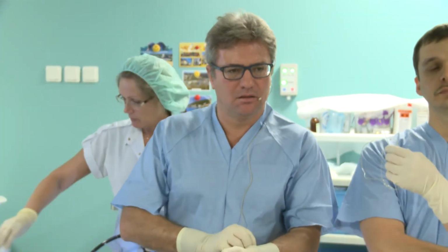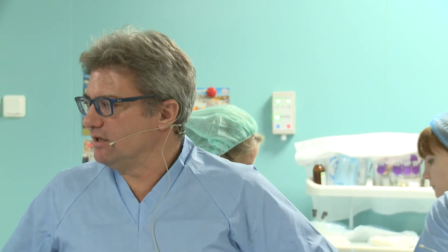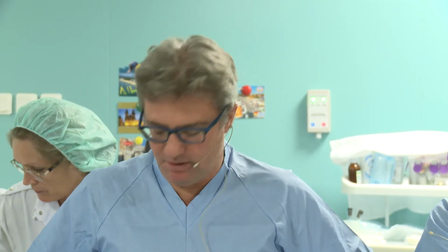Do you usually have opportunities to perform cystography during this procedure? Cystography, by contrast enhancement, by X-ray. I don't think you need to inject contrast. You just need to do it in the fluoroscopy room to see the guide wire and to see the placement of the stent.